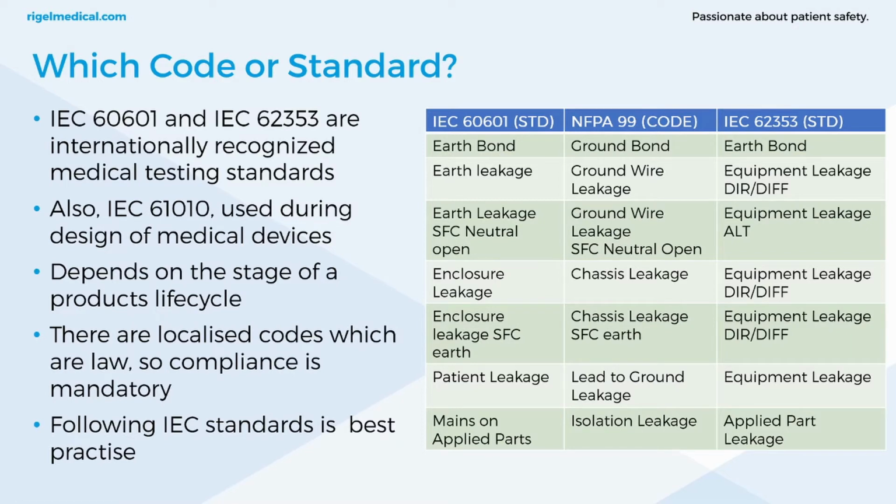Also, there's IEC 61010, but this is used during design of medical devices, so we don't talk too much about this for this type of application.